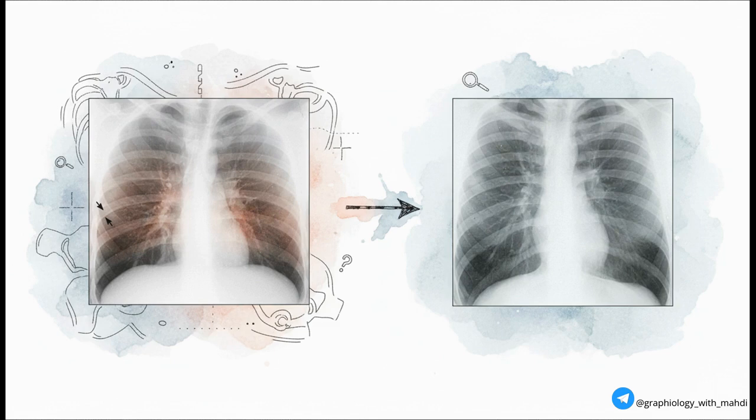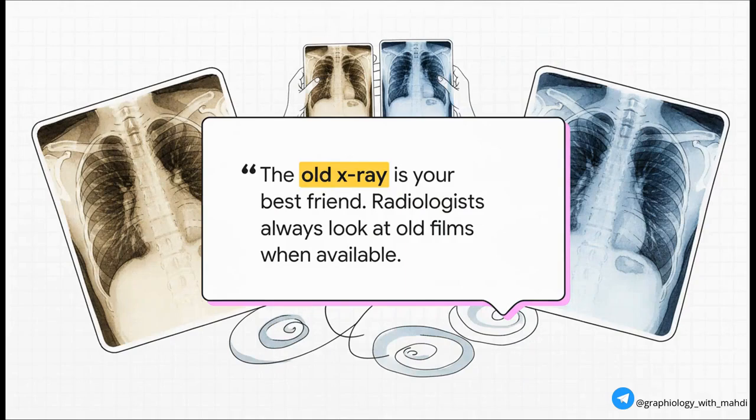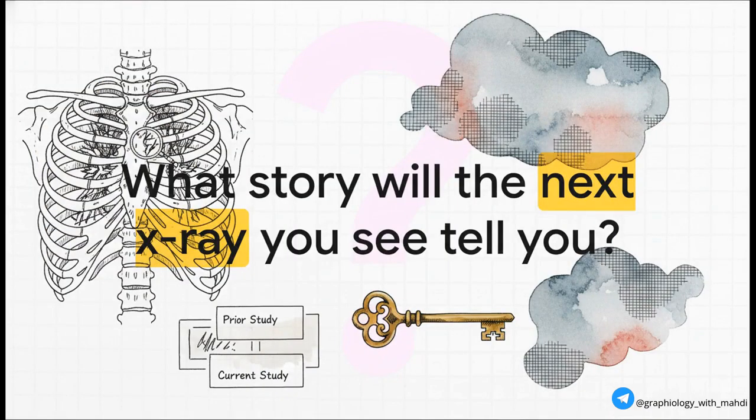Is it new? Is it growing? These are the critical questions that comparison answers for us. This idea is so important, it's a foundational rule in radiology. The old X-ray is your best friend. Radiologists always look at old films when they can. You should too. This single comparison can help you spot brand new problems or track the ones you already know about. The takeaway is simple. Never ever look at an X-ray in a vacuum if you can help it. Context is everything.